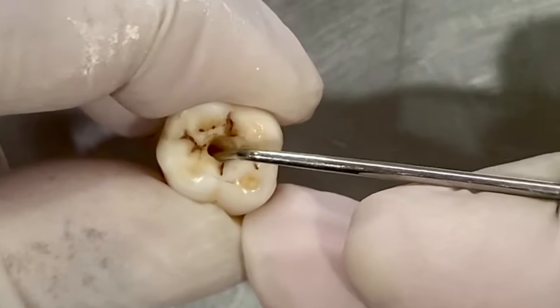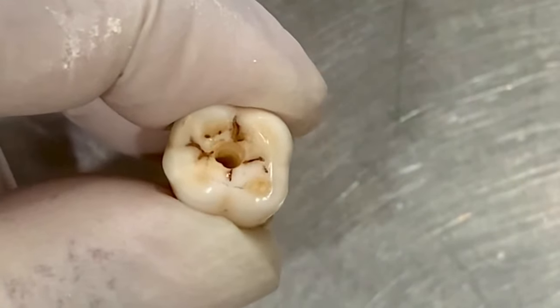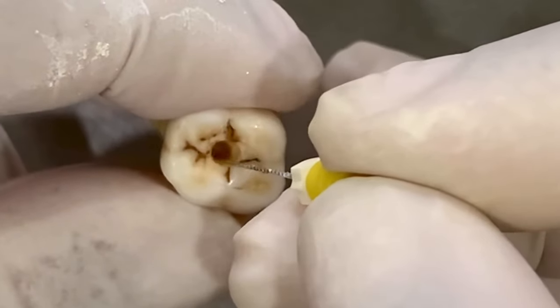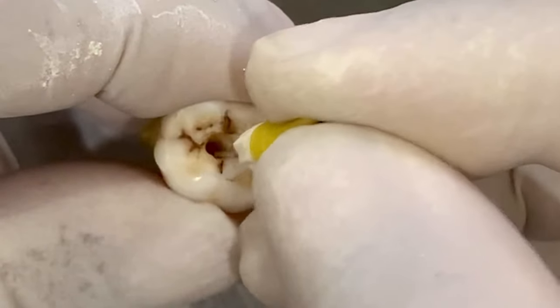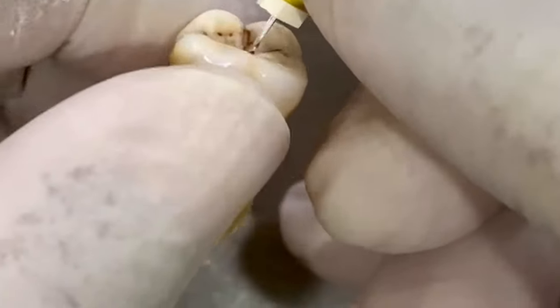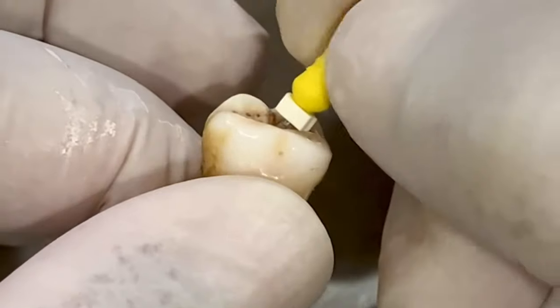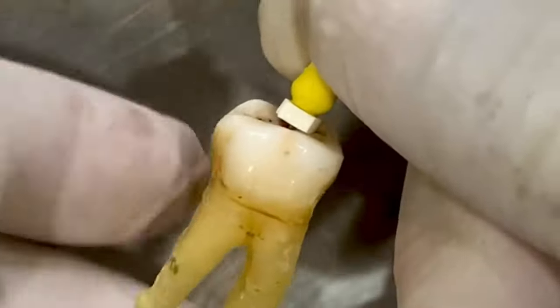I feel a catch here. Now I'll take a file and explore for the distal canal. I've taken a size 20 file because distal canals are mostly wide, and here it is easily entering. With a back-and-forth motion I enter into the distal canal.